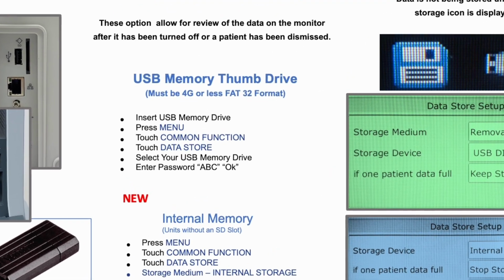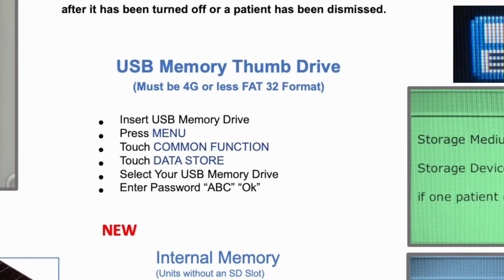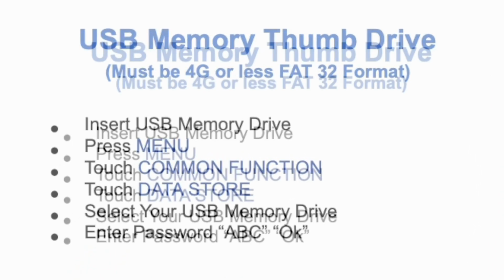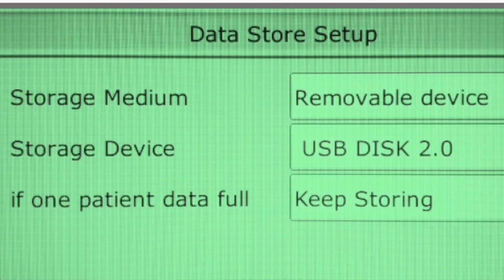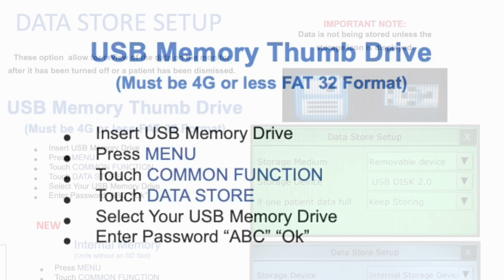The monitor will recognize the USB once you exit the data store menu and return. Please note, the thumb drive must be 4 GB or less and formatted to FAT32. Once inserted, press Menu, touch Common Function, touch Data Store, then choose the storage medium and/or storage device. You may be prompted for a password. The default password is ABC.